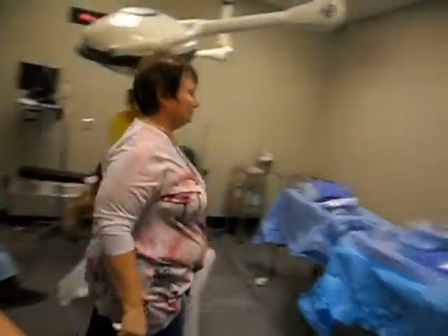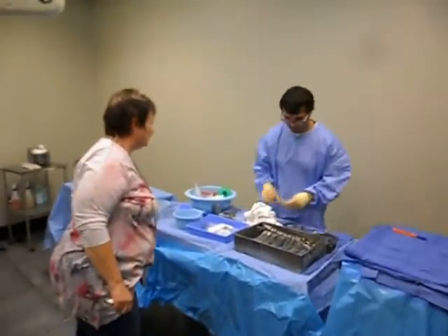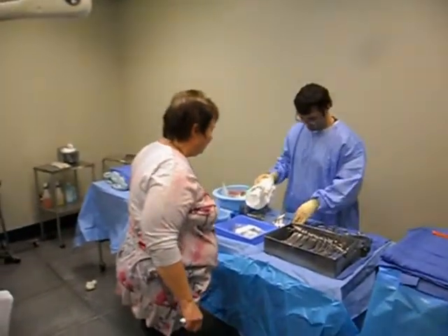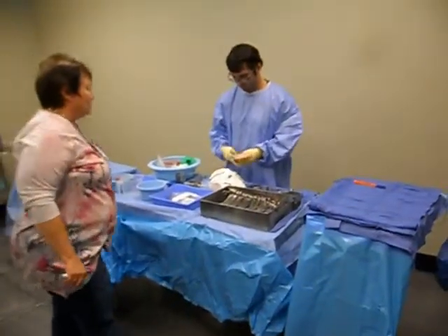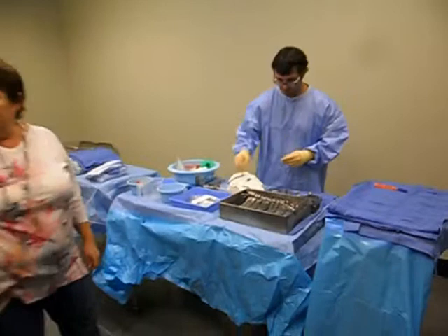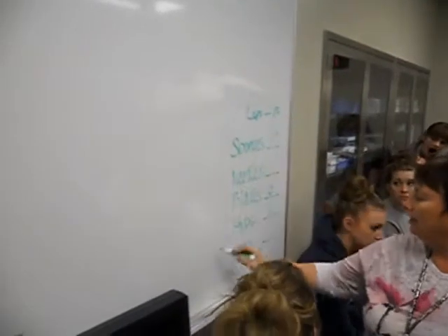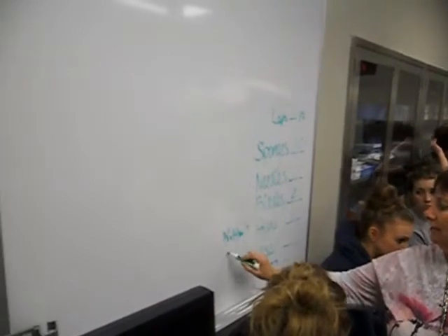How about blades? 1. I definitely need more blades. And then the one that's on there already probably would be on there. And that was in your set like that? All right, let's count our needles. 1. You have 1 needle, definitely get some more of those. 2 blades, no hypos. Kittners, 5, and you have suture booties, 10.